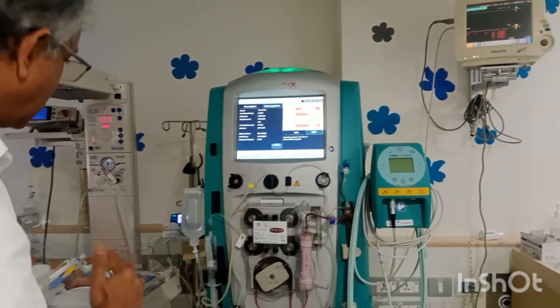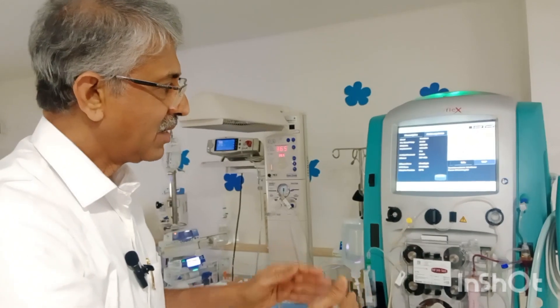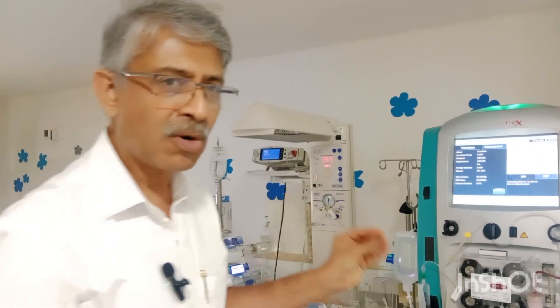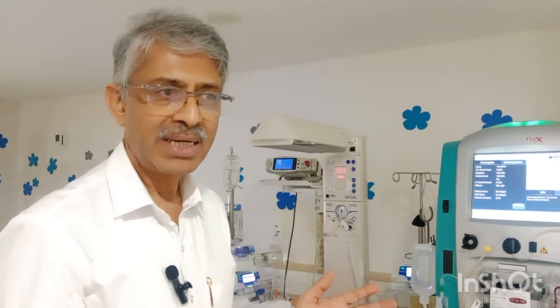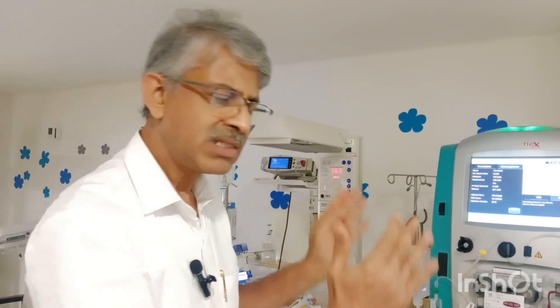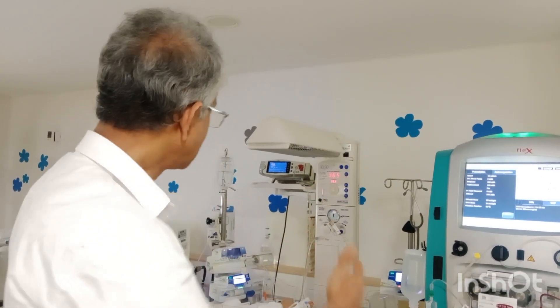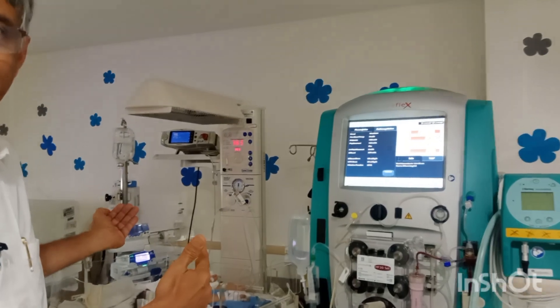For this baby, when it came in, we were able to attach this machine and do dialysis within a few minutes after arrival. We all know that hyperammonemia is an important condition in neonates which can cause increased morbidity and mortality. It is very essential to start medication and therapy as early as possible. Dialysis — that is renal replacement therapy — is very important in addition to other medical lines of treatment. Of course, the baby required ventilation and intensive therapy. This is the highest state of intensive therapy one can have in any unit. Thank you so much.